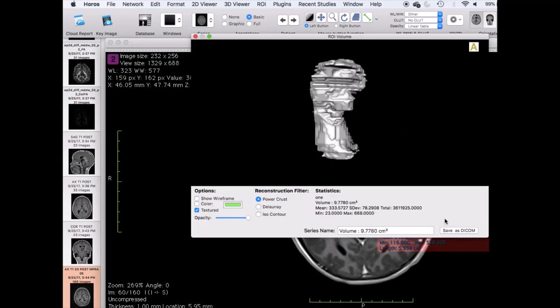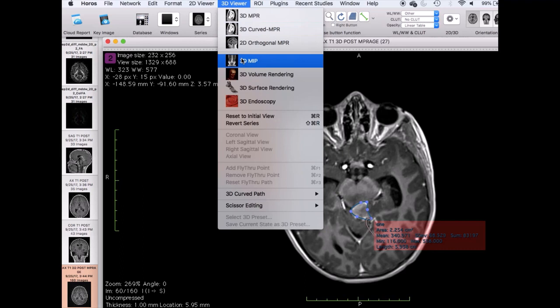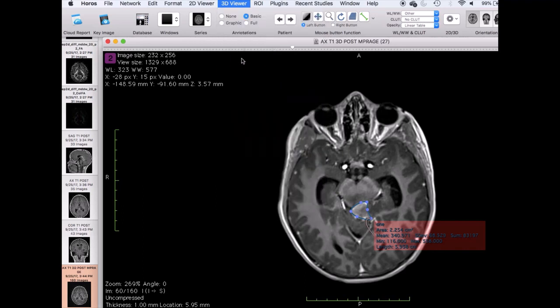To visualize a 3D rendering of the tumor, press 3D viewer and select 3D MIP. The 3D tumor will be visible within the patient's 3D reconstructed skull.